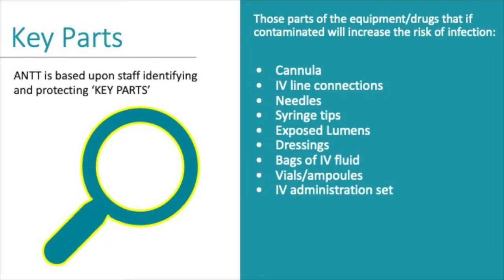Key parts. So another example of a key part is the end of your IV lines. So I want to make this message really clear that only an IV trained nurse is able to disconnect an IV giving set. 3 reasons. 1, that medication may be up for a particular reason, for a particular time, therefore we should not delay that medication. Second, you always have that risk of contamination when disconnecting a line. Third one is that even if the medication has finished, the line will still need to be flushed.